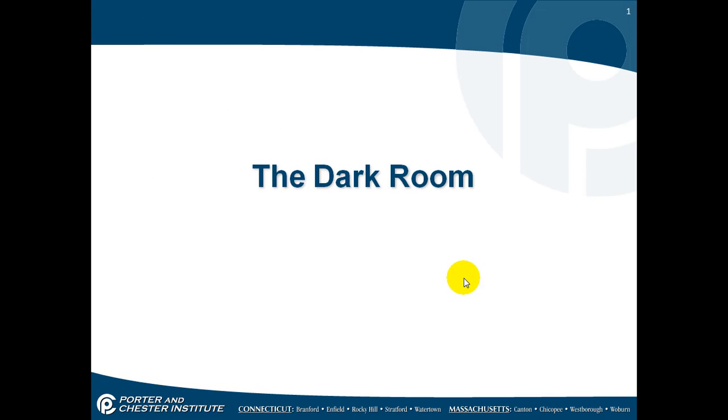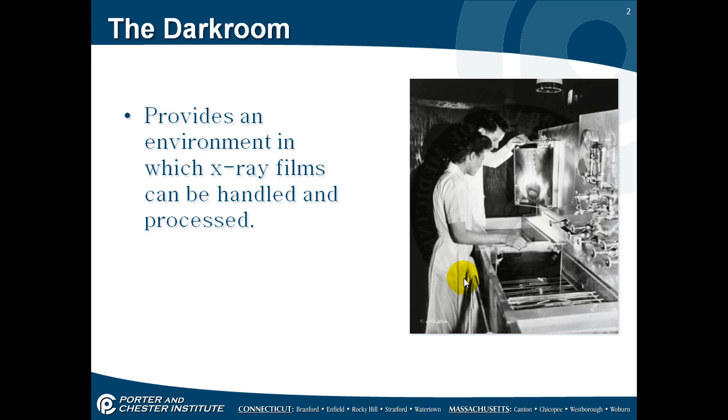We're going to talk about the darkroom. The darkroom provides an environment in which X-ray films can be handled and processed. Today, of course, with digital, X-ray rooms are used less and less, but we still do use them.